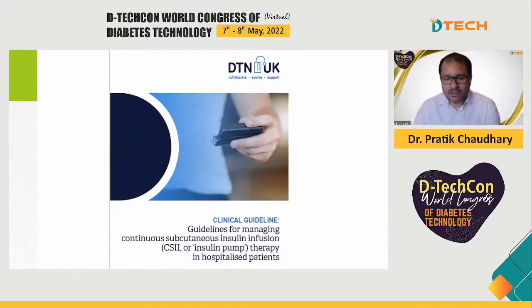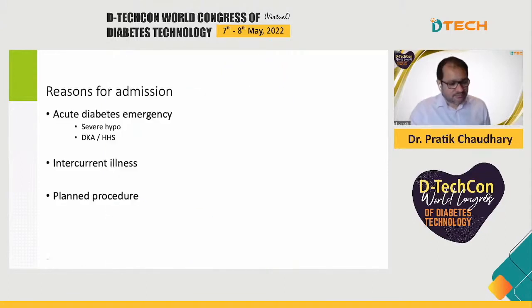So as part of the DTN, we recognized that there was a need to create some guidance for people using different technologies in hospitalized patients. The first guidance we created about 4 years ago was this clinical guidance. Again, you could just Google DTN UK and you'll find this guidance. It's free for anyone to download. And the first one we created was, what do you do if someone on a pump comes into hospital? How should that be managed in hospital?